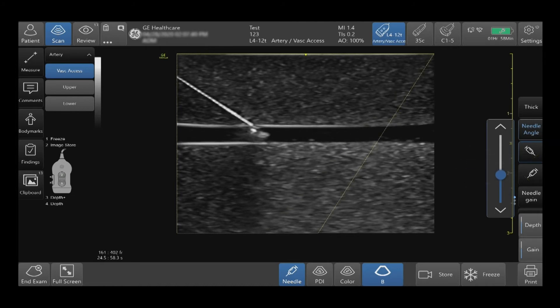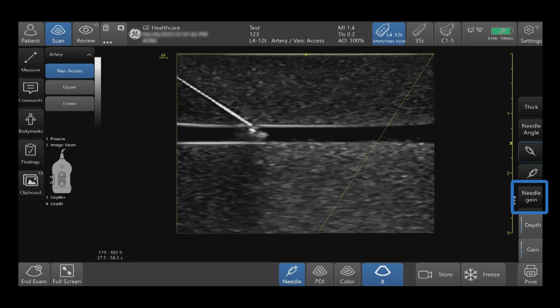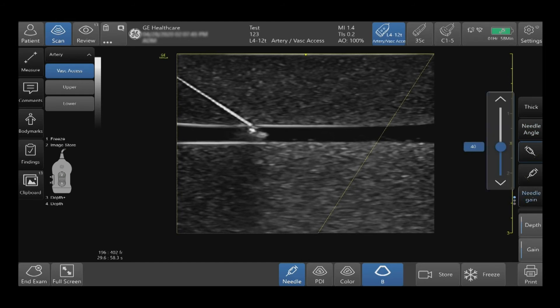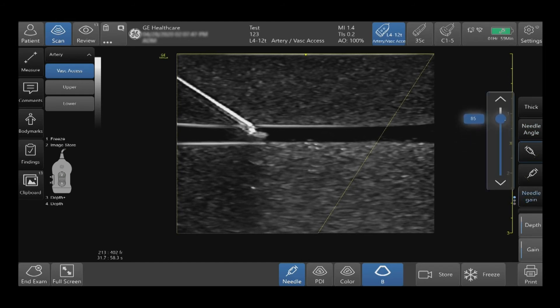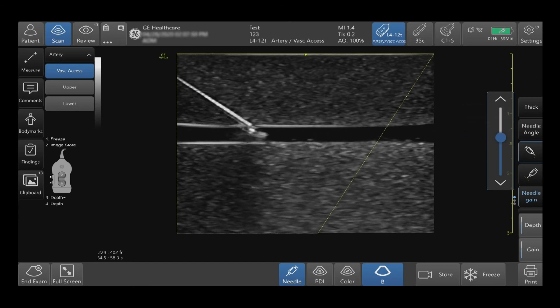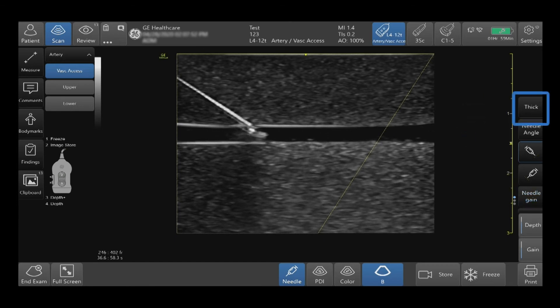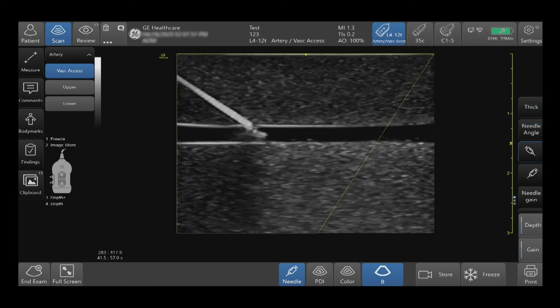You can also adjust the brightness of the needle reflection by adjusting needle gain. Here you can increase and decrease your gain. By selecting thick, you will toggle between a thinner or thicker appearing needle reflection.